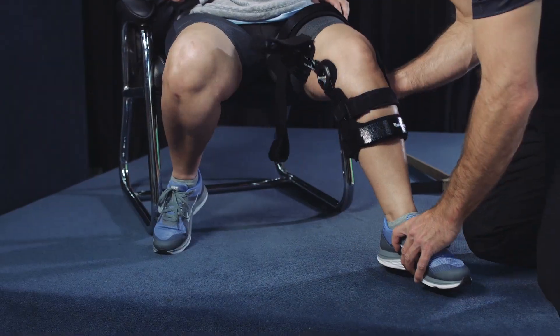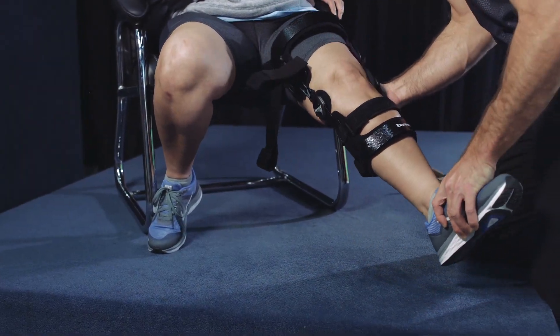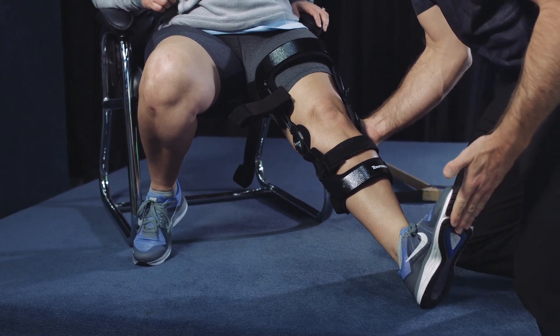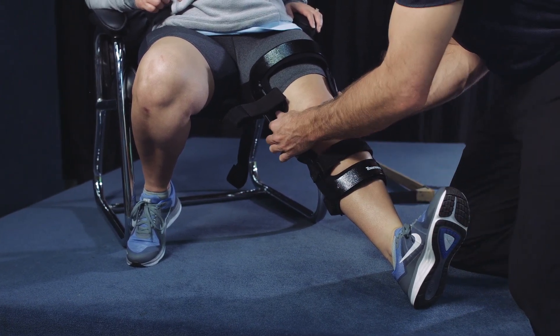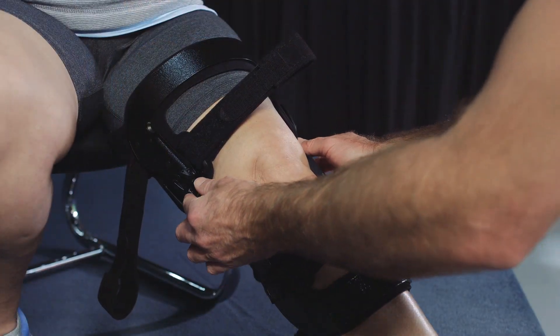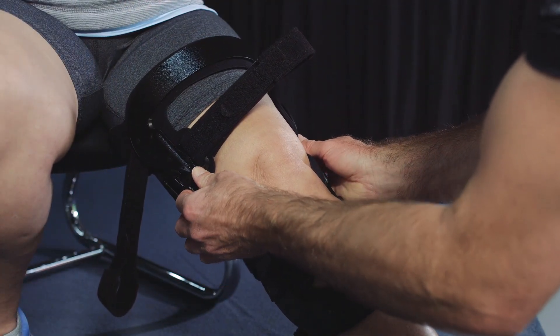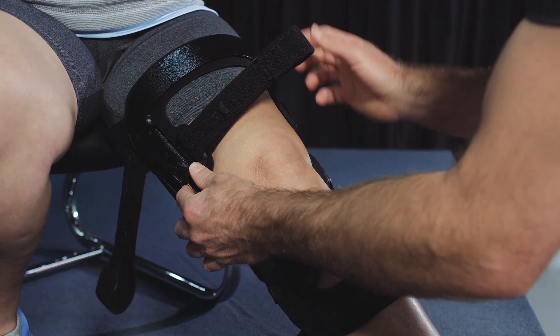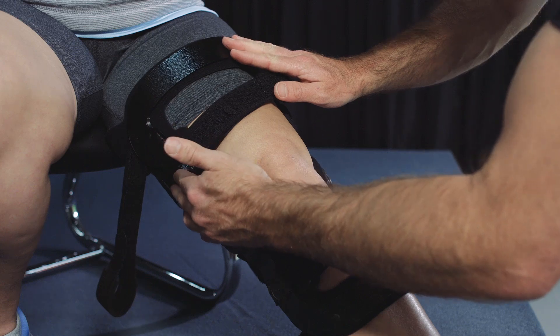With the patient seated at the edge of the chair, have the patient flex and extend their knee. With the knee fully extended and the heel resting on the floor, have the patient dorsiflex their foot. Adjust the position of the thigh shell by extending or shortening the load shifters on each side so that the thigh shell fits the resting position of the patient's thigh or Q angle.